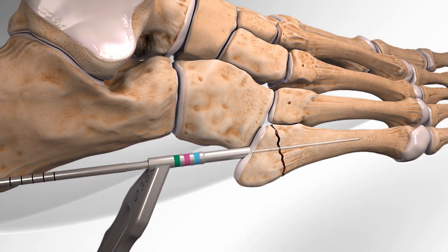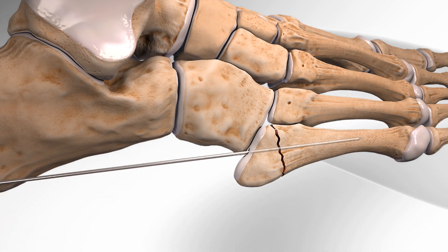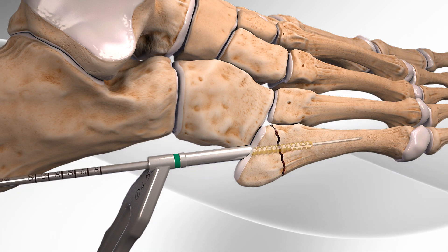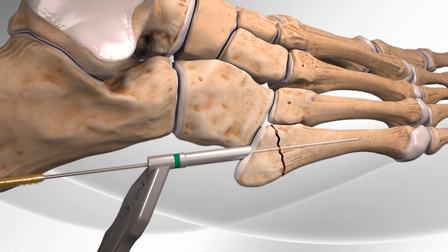The surgeon drills past the fracture site and avoids drilling the outer shell of the bone. The surgeon then taps to the desired length for placement of the surgical screw and measures the screw length.